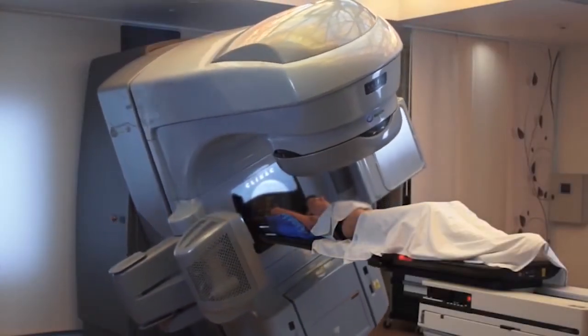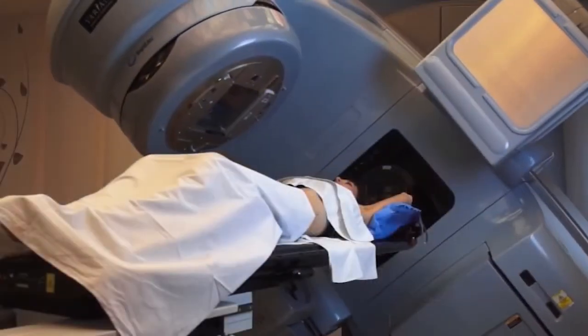This is the Linear Accelerator at the Northwest Cancer Centre. It uses electricity to make two types of radiation.